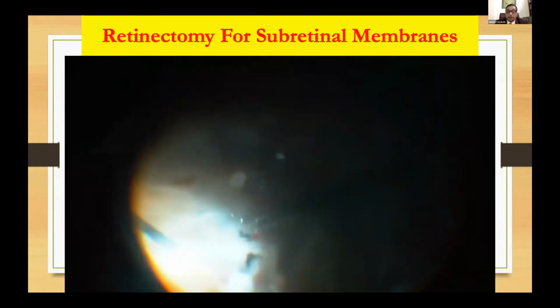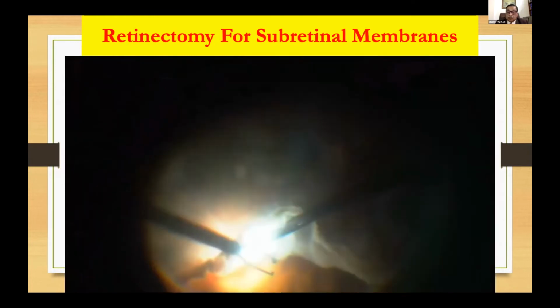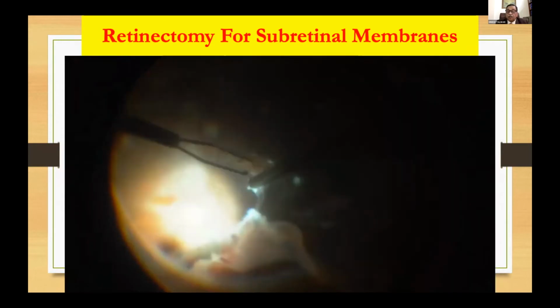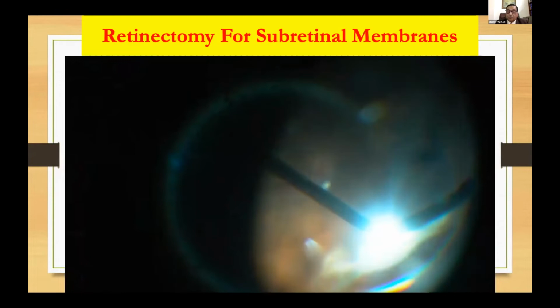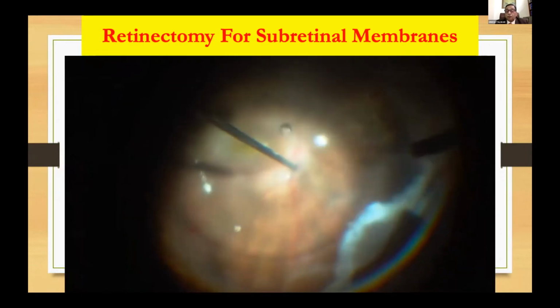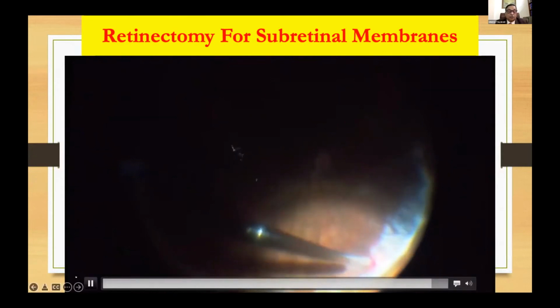And after this retinectomy is done, you will find that you get access to this subretinal membrane, which has been removed. And then you find there's another subretinal membrane adjacent to that. And this was accessed and removed. And after this is removed, you put PFCL further to bring it to the level of the retinectomy, see that it settles, and go ahead and do laser and complete your surgery.